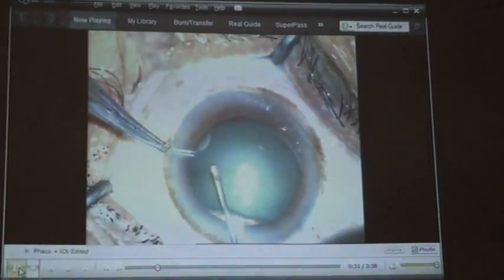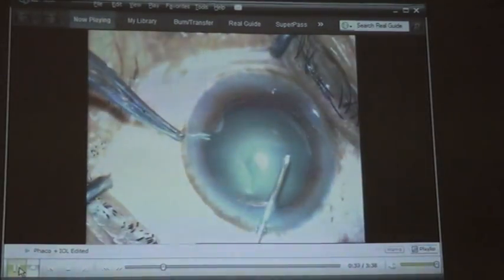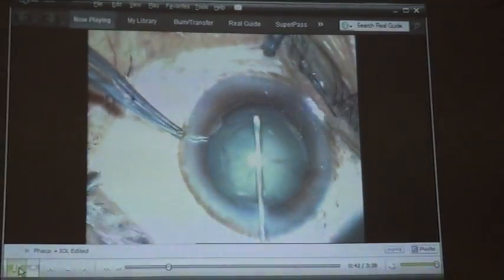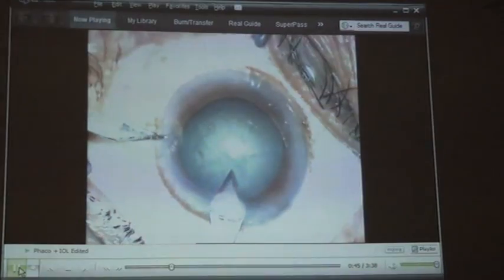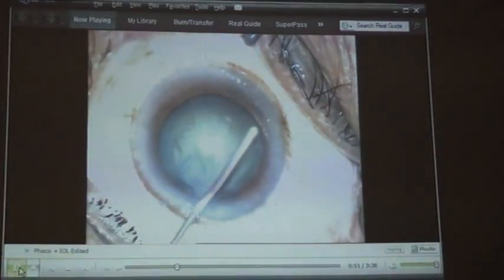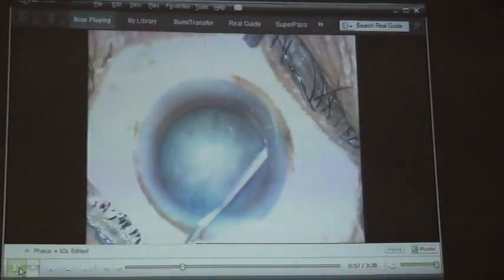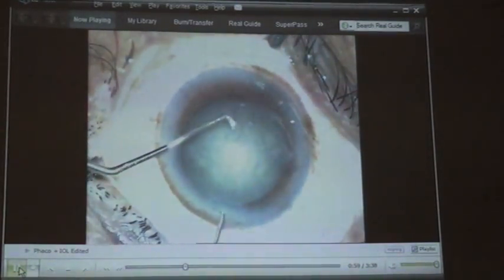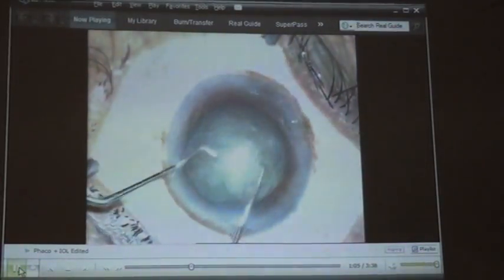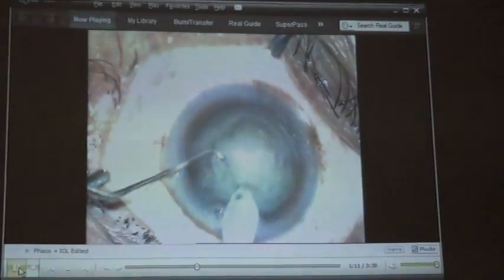Making an opening on the anterior capsule. This will be around second opening. Delineating the nuclear material from the capsular bag. Rotating the nucleus and making it free from its attachments. Phacoemulsification probe.